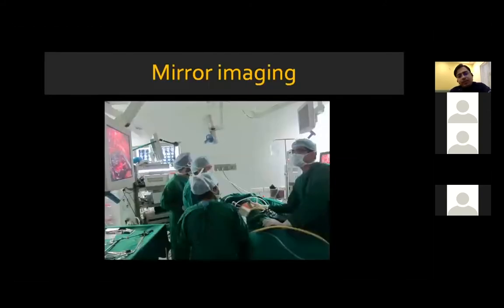Mirror imaging is an important thing. Your assistant is retracting the ureterogonadal packet standing opposite to you, and he's seeing everything that you see in a mirror image. So don't expect him to be as facile as you. Put in an instrument in the retracted position and then only hand it over to the new assistant.